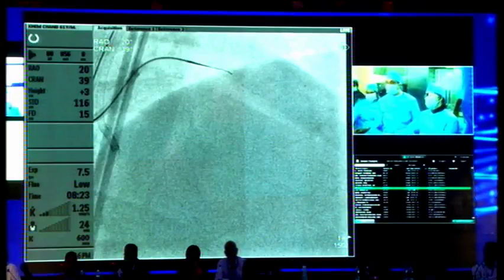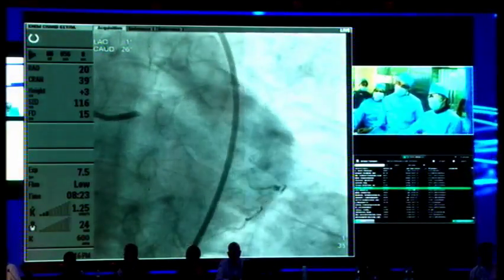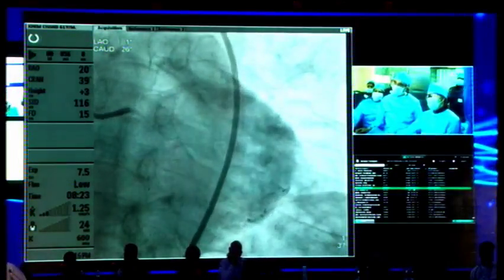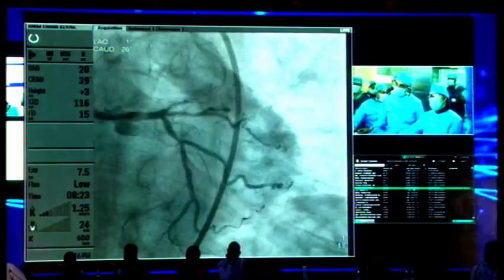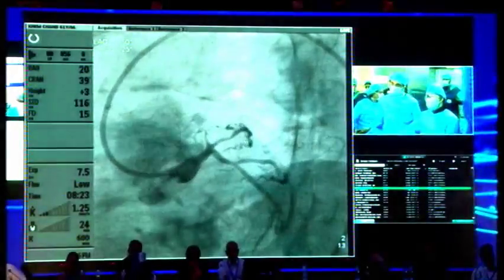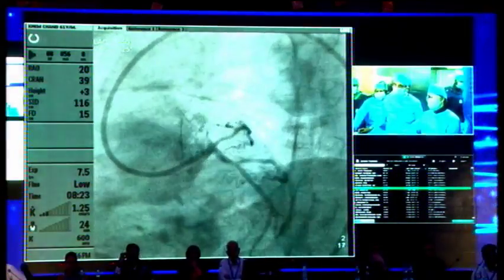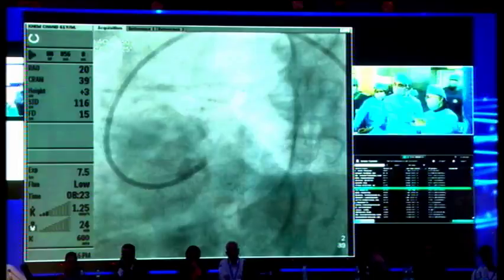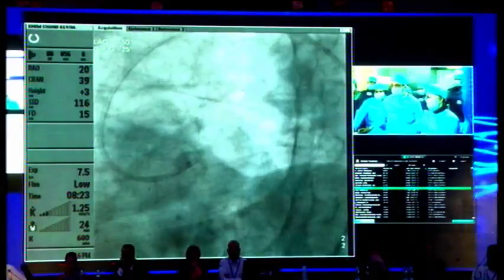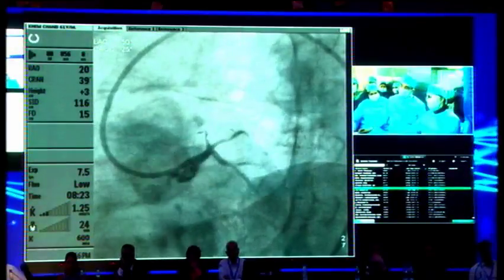First angio. This is a proximal LAD in-stent occlusion, but the problem is that the inflow of the stent is occluded and very much tapering away, and there are some intra-lesional or bridging collaterals. Next. This is a spider shot. It is a very good orientation as well as a guiding catheter, because this gentleman has a narrower left main to LAD direction. So this EBU 3.0 is fitting very well for the direction of the LAD. Next.